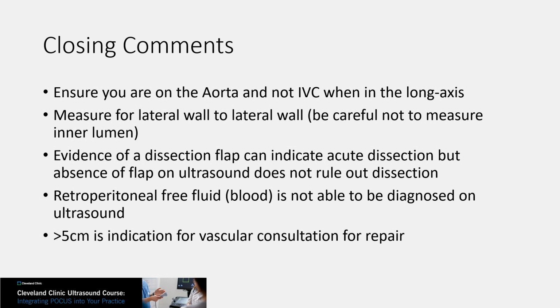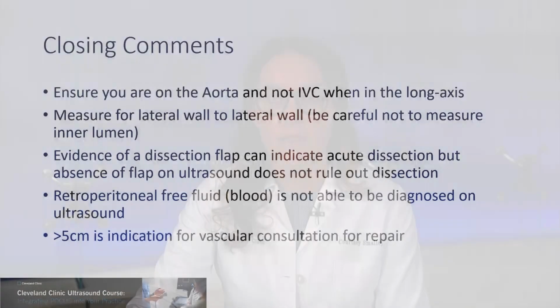Last but not least, greater than 5 centimeters is an indication of vascular consultation for repair. Many times in the emergency setting, we are concerned for acute rupture or potential rupture, and we will get vascular surgery involved if we are concerned at any time that the vessel is greater than 5 centimeters.